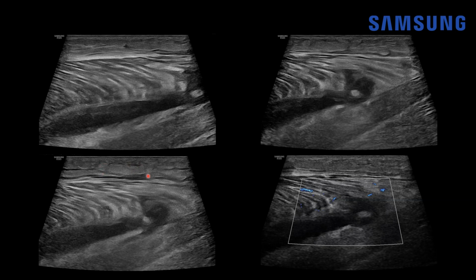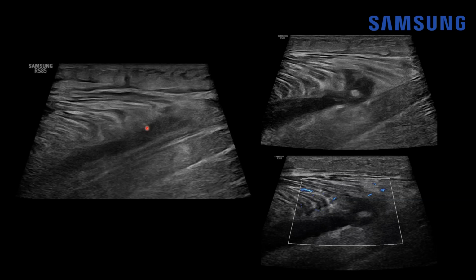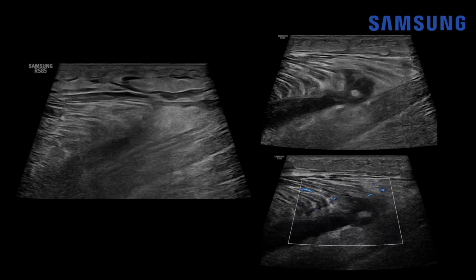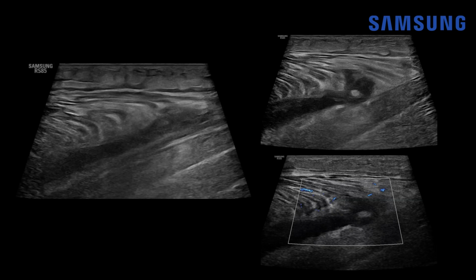There's also some edema in the subcutaneous fat, and these disrupted muscle fibers, both of the medial gastrocnemius and adjacent soleus, and also some mild hyperemia about that region on microvascular flow imaging. Let's look at this on real-time imaging, again showing that heterogeneously hypoechoic hematoma there at the site of muscle and myoaponeurotic disruption with subcutaneous edema and edema within the adjacent muscle.